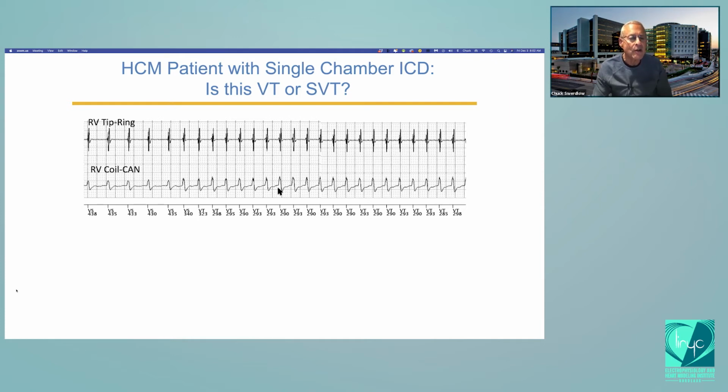The signal is not any more wide or narrow. It's got a big positive deflection and a slightly smaller negative deflection, and their shapes are about the same. In fact, if you put this on top of it and stretched it up and down, like in a funhouse mirror, they would match.